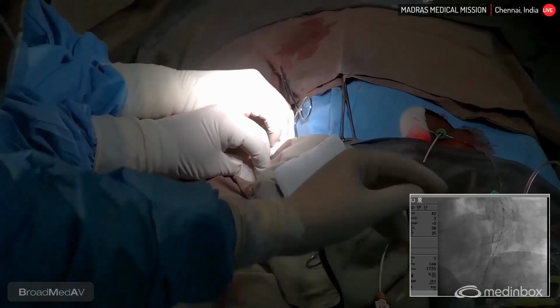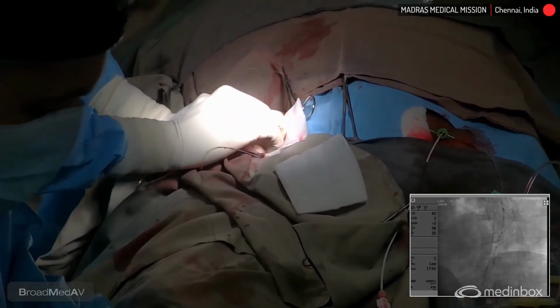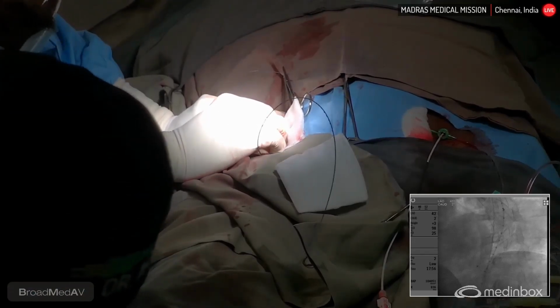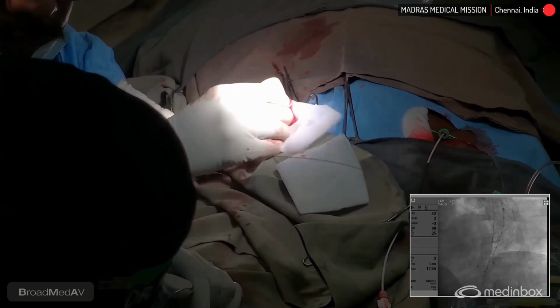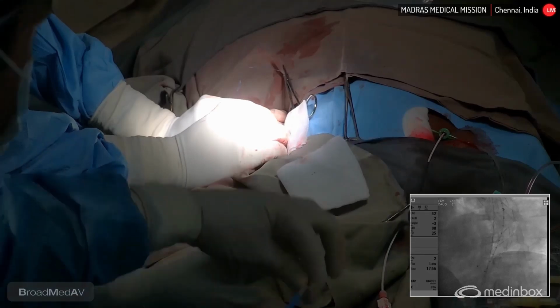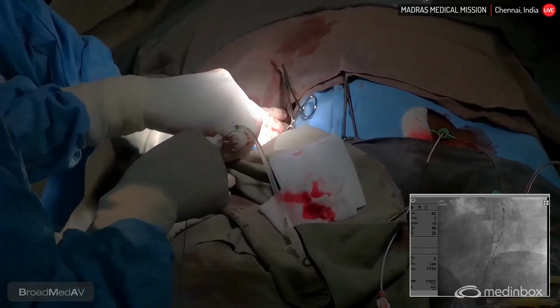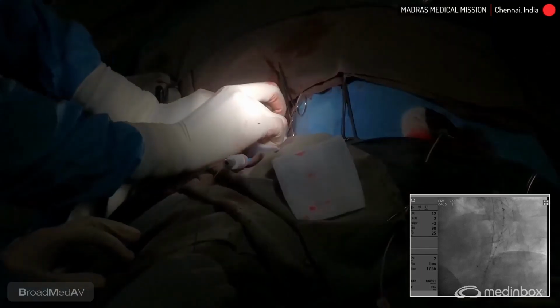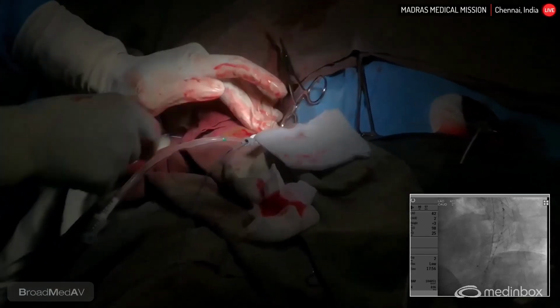Okay, now this is the important point where the groin has to be compressed well. There's a 24 French rent in the common femoral. Sheath fast. The common femoral artery size here is almost 9.5 to 10 millimeter. Hence, I think we can leisurely put 3 ProGlides. Suppose if the common femoral artery size is a little lesser, what is your strategy, sir? Suppose 3 ProGlides are going to constrict the vessel, if you feel, how are you going to manage in that particular situation?